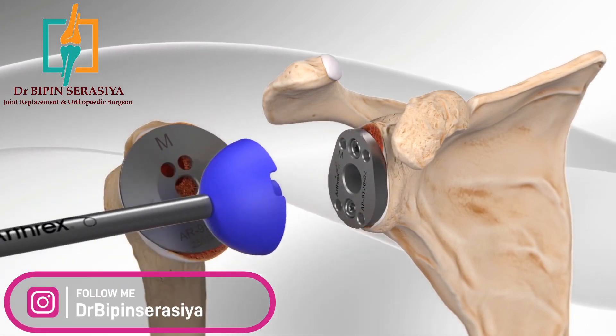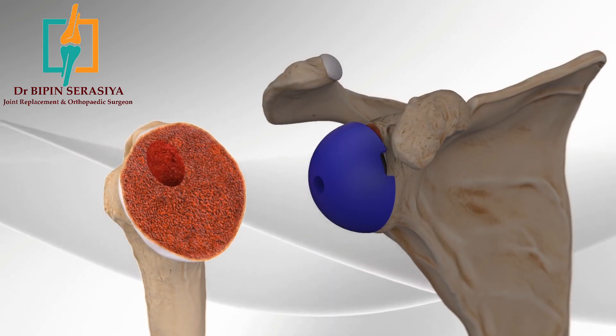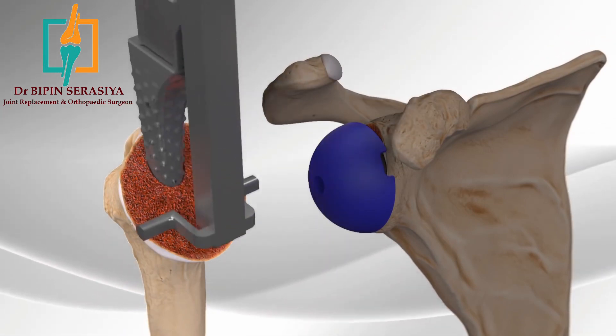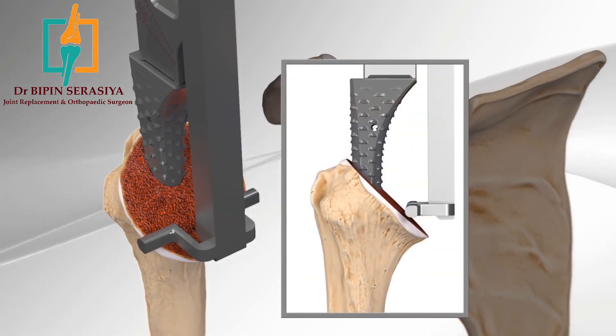A trial implant is placed on the plate to determine the proper size and fit. The metal plate on the humerus is removed and final preparation of the humerus is initiated. Final humerus preparation is carried out by placing a series of instruments down the canal in the bone to determine proper implant size and angle.